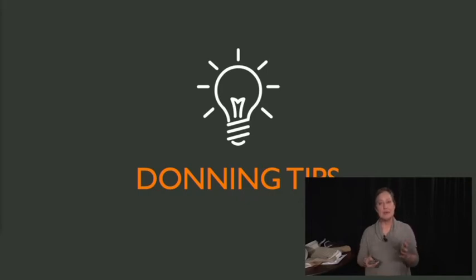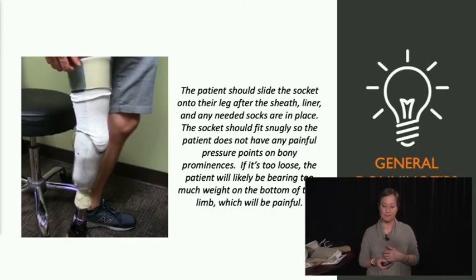So I'm going to give you a few general donning tips. This is big picture stuff across the board. Again, for you OTs out there, perfect thing for you to be working on as well for our patients. So this kind of works them through what should happen. They slide the socket onto their leg. We've talked about that in a couple different ways. Snug is what you're looking for. They should have a good snug feeling.